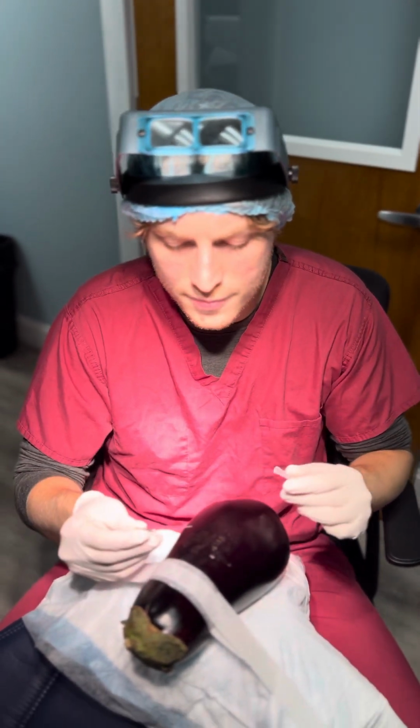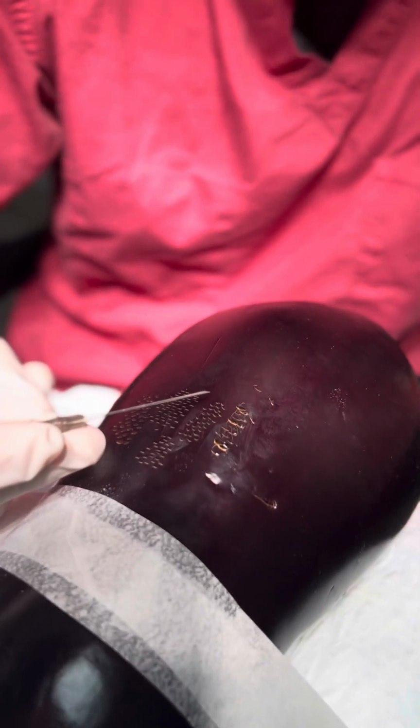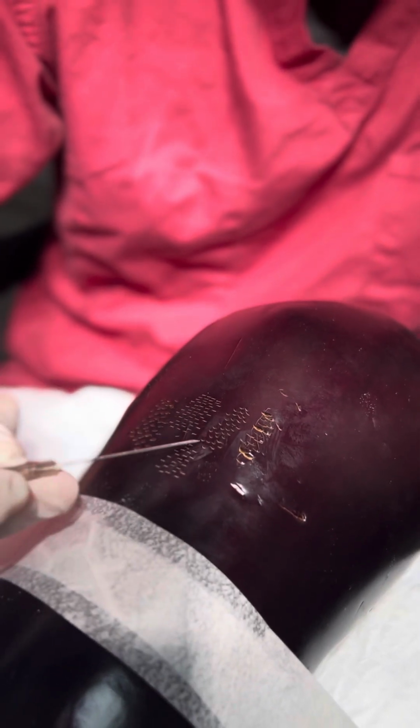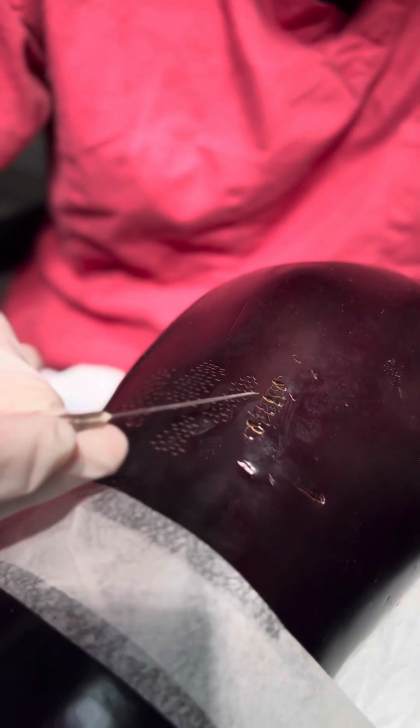We were also sent some new needle sizes, and this is one that we tested out here. These are the incisions that this needle was able to make, right around about here. You can see they're not perfect. They're better than the implanter pen incisions here, but certainly not perfect.